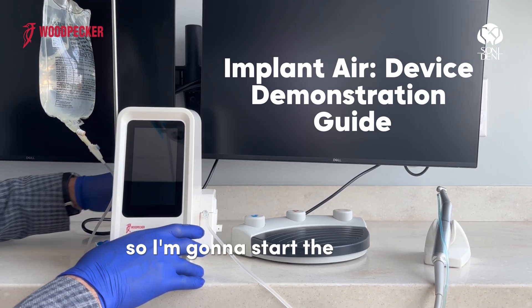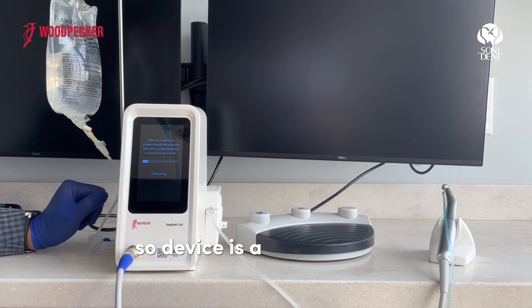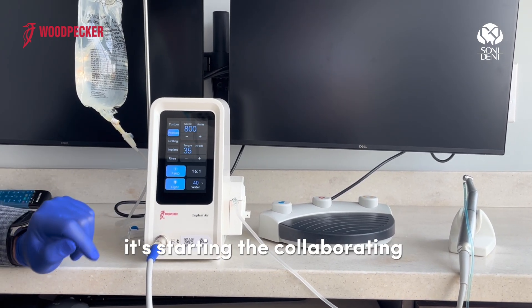I'm going to restart the device right now. The device is starting auto-calibrating. Every time you are restarting the device, it restarts the calibration by itself.